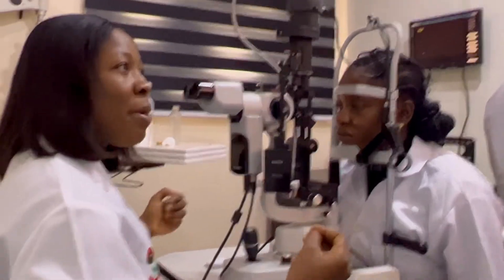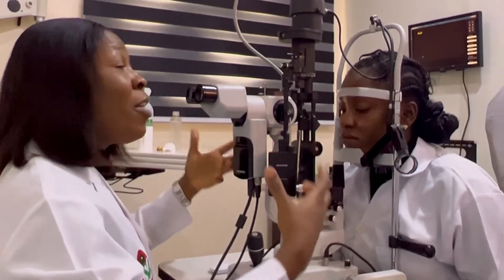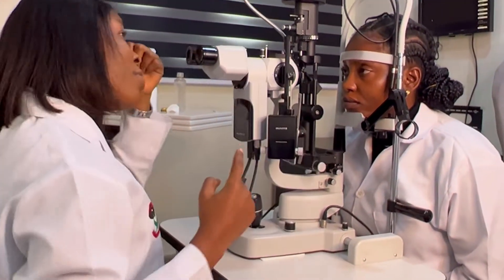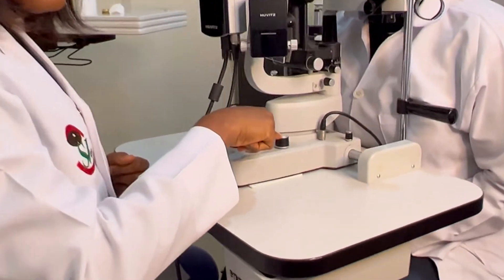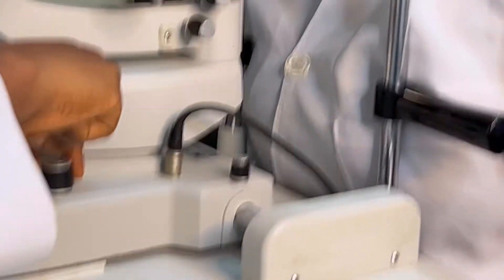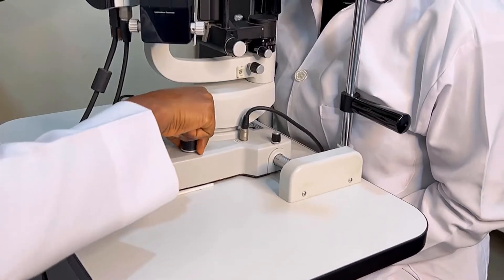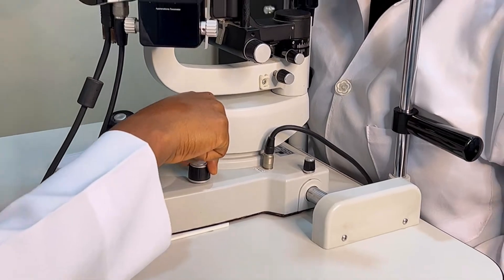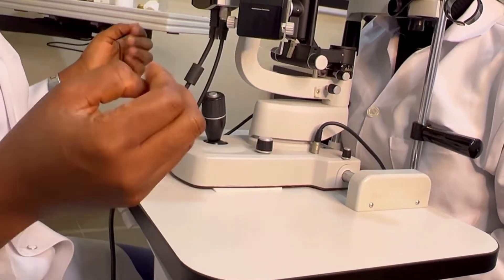Next is the instrument preparation — the instrument itself you're going to use for your practical. You need to prepare the instrument. In instrument preparation, the first thing to note is the rheostat. This rheostat controls the intensity of the light — it increases or decreases the intensity of the light. Make sure the rheostat button is at its lowest setting.